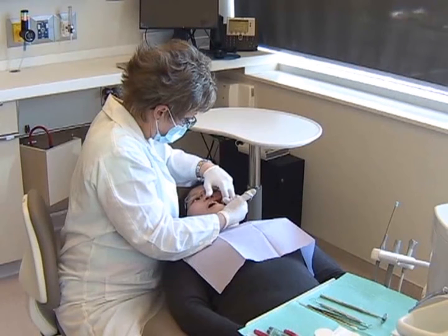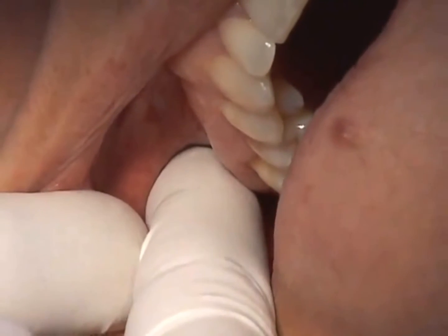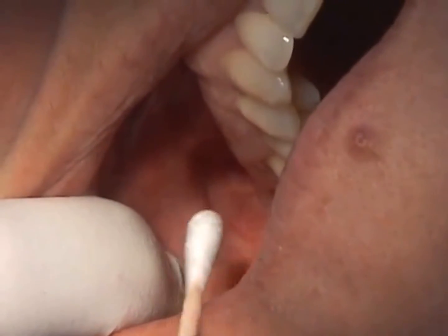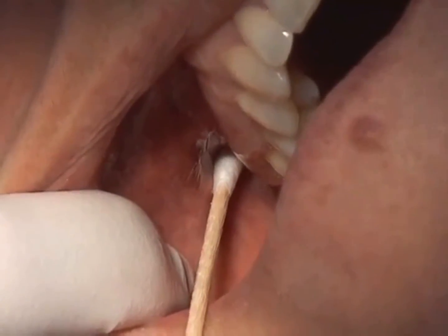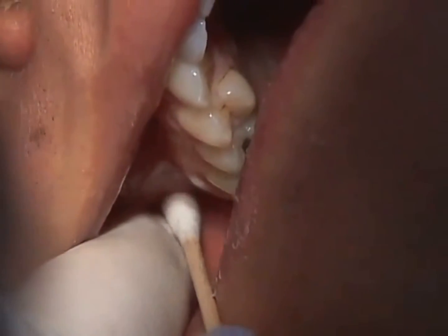For this injection, it's helpful to have the client partially close and deviate their mandible to the side of the injection. This improves the field of view, allows for better retraction, and facilitates the ability to maintain the required 45-degree angulations. Palpate the zygomatic arch. The penetration site must be posterior to the zygoma. Feel for a soft area behind this bony landmark. This is the injection site.